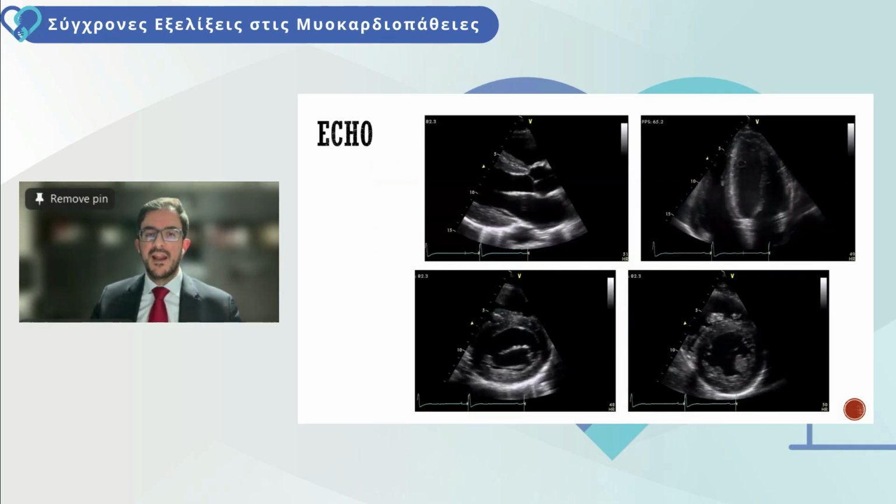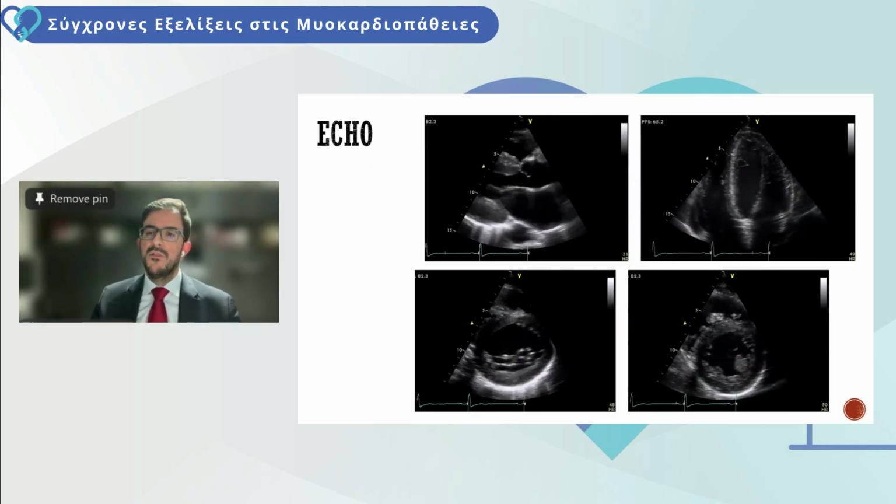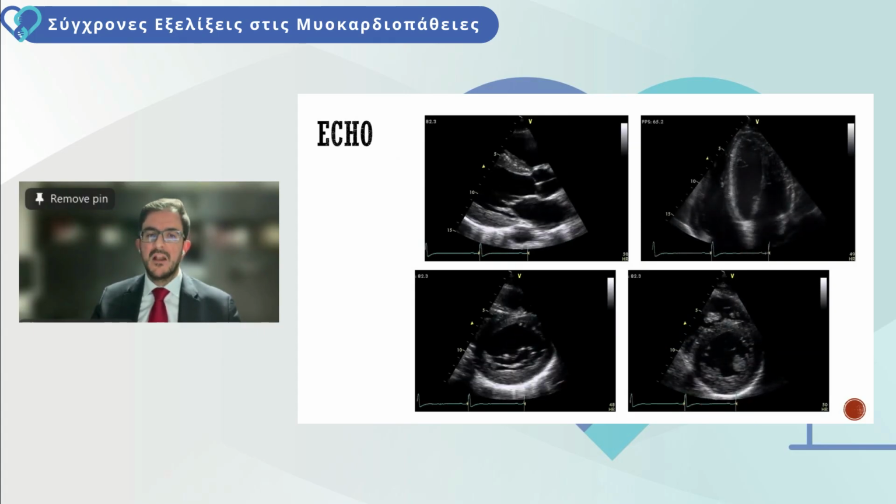And if we go to his transthoracic echocardiogram, you will note that he's got some mild hypertrophy, potentially at the base, and I'll show you the measurements in just a second. His left ventricular cavity seems reasonable because, as we know, in pathological states, we get concentric hypertrophy rather than the eccentric hypertrophy of exercise. However, it's important to remember that up to 20% of black athletes exhibit concentric hypertrophy. And in your four-chamber view, you're able to see that the apex looks reasonable, but perhaps there is a bit of apical displacement of your papillary muscle.